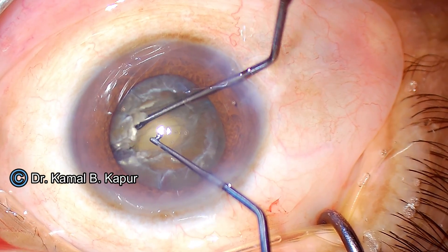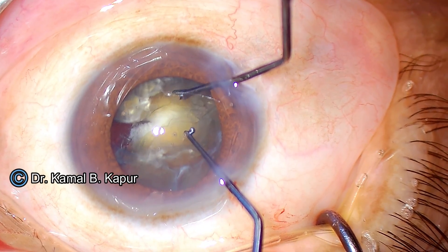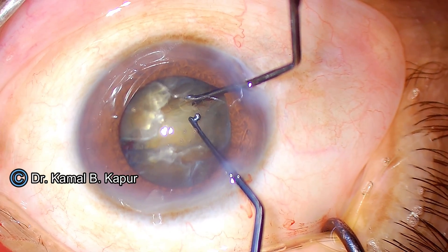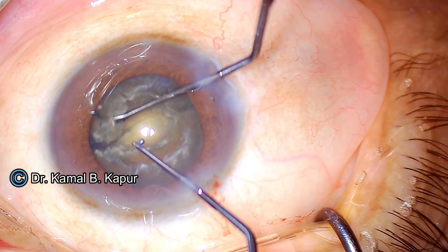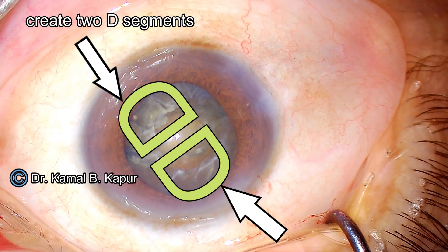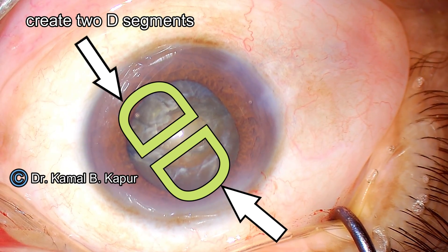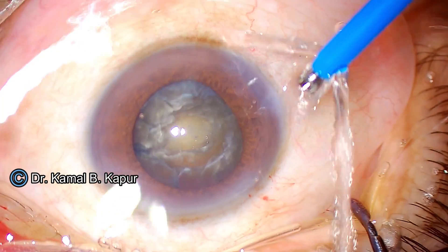We use two blunt instruments for a very controlled cracking, starting from the area where it is already cracked and slowly directing pressure toward the uncracked area. While doing this we must ensure there is no jerk and no posterior pressure — the cracking pressure is only in the lateral equatorial sides of the capsular bag. You will notice that we could crack the nucleus into two D segments.